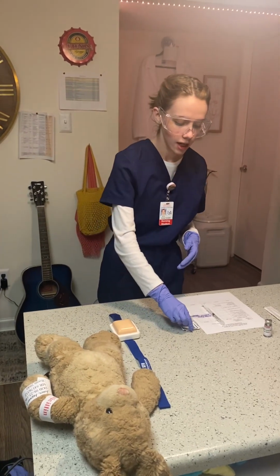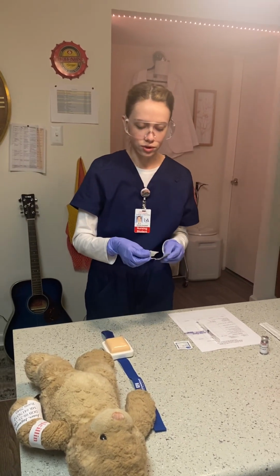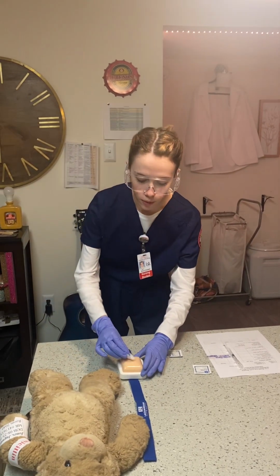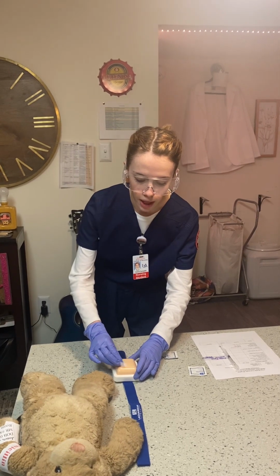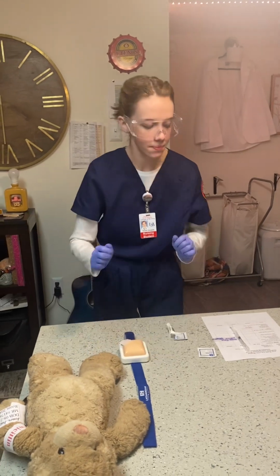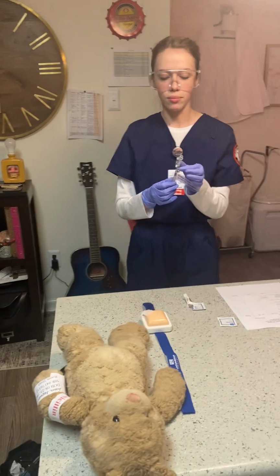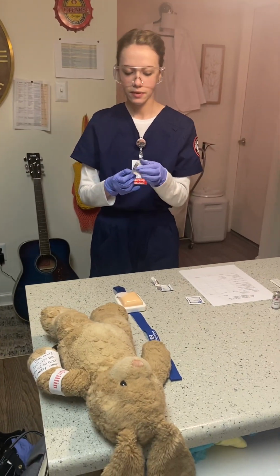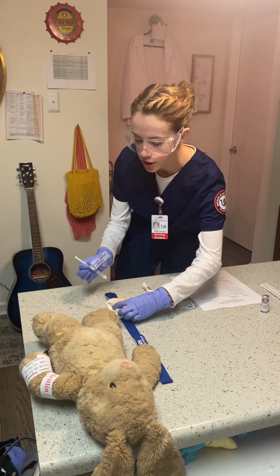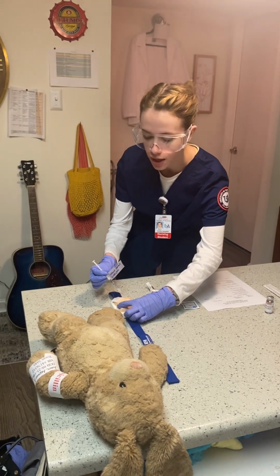I'm going to grab my alcohol prep pad. I'm going to rip that open, and I'm going to clean the administration site. I'm going to clean from the center, going outwards, and I'm going to leave the alcohol pad here. I'm now going to grab my medication. I'm going to move down the safety. I'm going to pinch 1 inch of the patient's skin and administer this medication at a 45-degree angle.